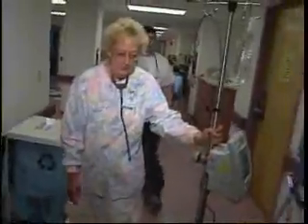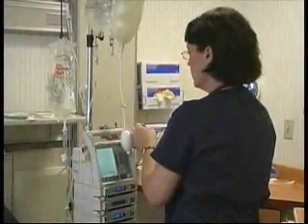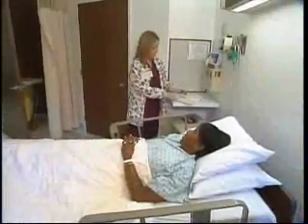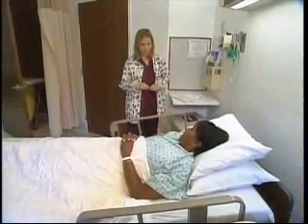Additionally, the professional and the educational background of the nurse will play a part toward overall skill development and procedural competency through appropriate patient assessment and care strategies. Most organizations do permit nurses to attempt peripheral short catheter insertion after attendance at a program with an associated laboratory practicum. Nurses are then observed in the clinical arena for insertion technique and other skill sets necessary for catheter placement and removal, as well as maintenance practices.